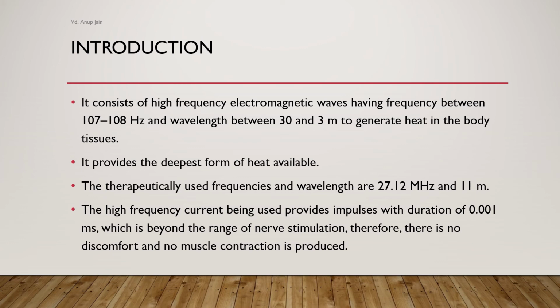The high frequency current being used in SWD provides impulses with duration of 0.001 millisecond, which is beyond the range of nerve stimulation. Therefore, there is no discomfort and no muscle contraction is produced, making it a safe treatment.